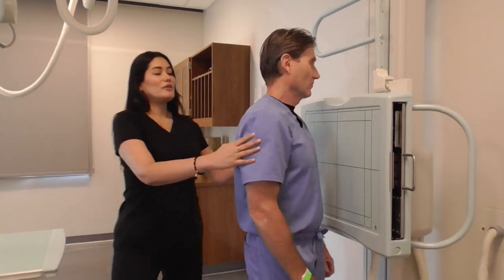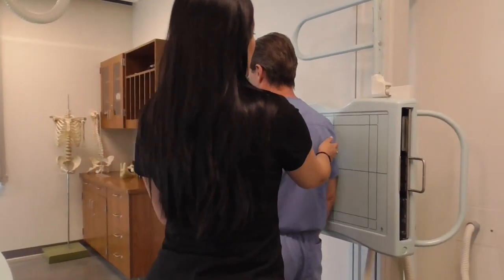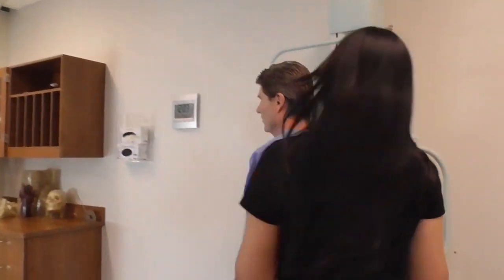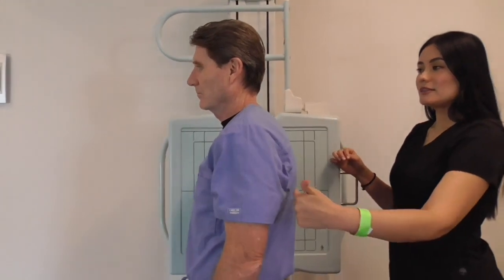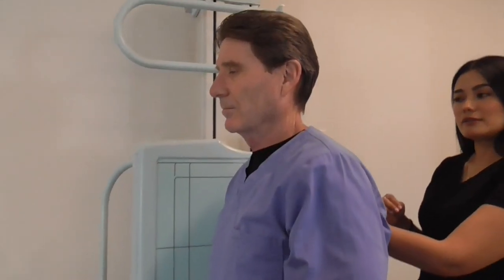We're going to do the right lateral. I'm going to have him turn with his right side closest to the IR. So now the beam is going to enter his left side and exit the right side. So this is a right lateral position.